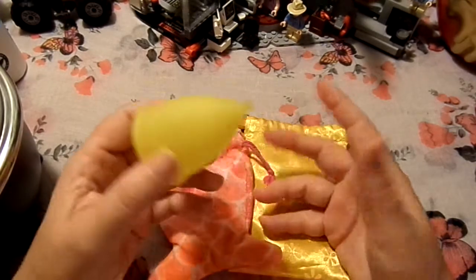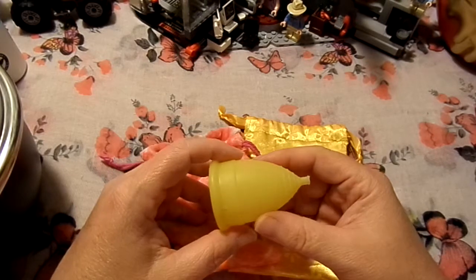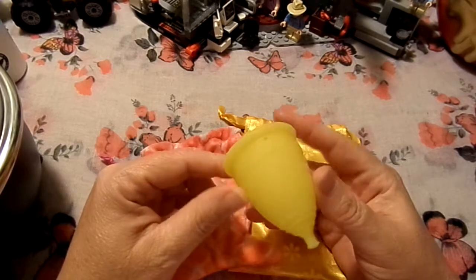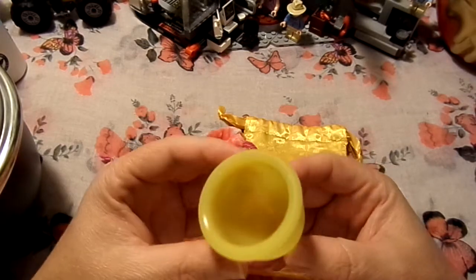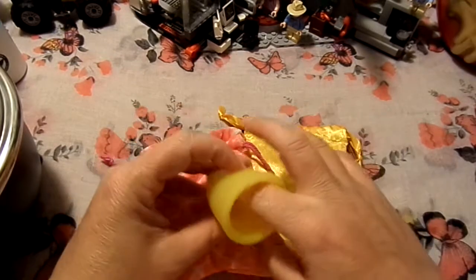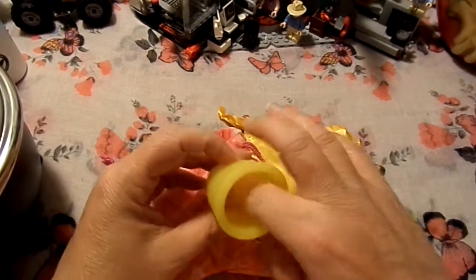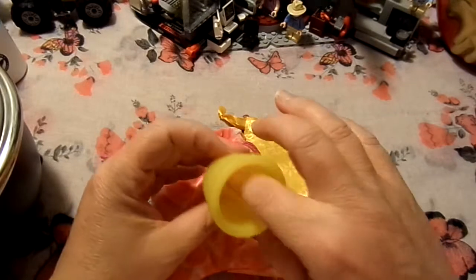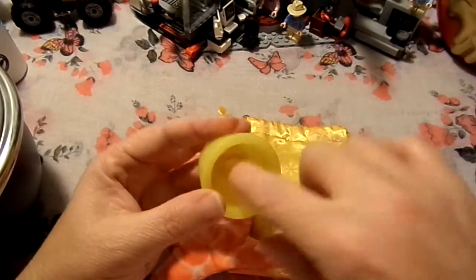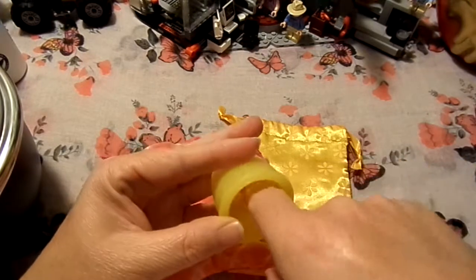I got it in yellow because I wanted a bright, happy colour. The Diva cup has measurements on it. I'm not sure if I showed you that. This one doesn't. I haven't actually worn this in a little while, so it's a little bit dirty. I'd probably have to boil it before I wear it again. I actually really enjoyed this cup.